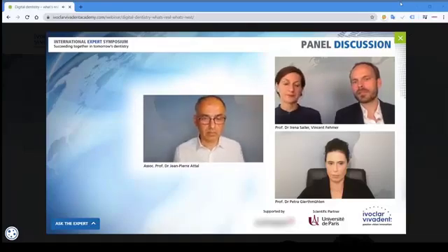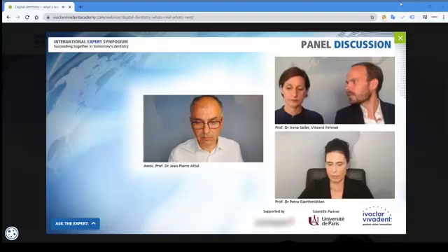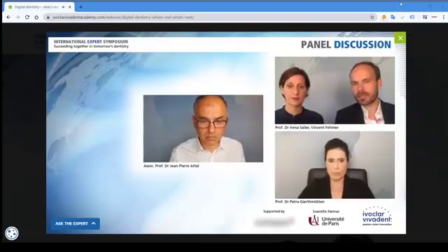On the other hand, as you saw in this clinical picture of this molar that we presented, you see this high precision of these two components once being glued together. So in the end, this is not really a cement gap any longer. You see here a very, very minor cement gap. So for sure it will have a different impact than any conventional cementation.